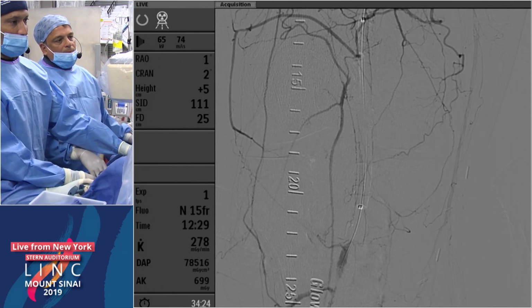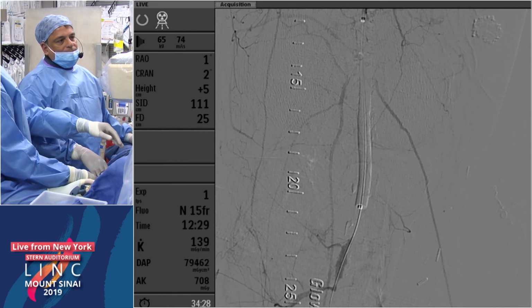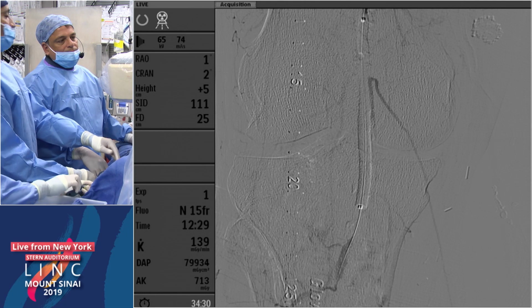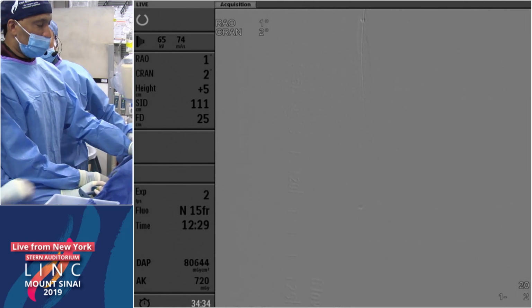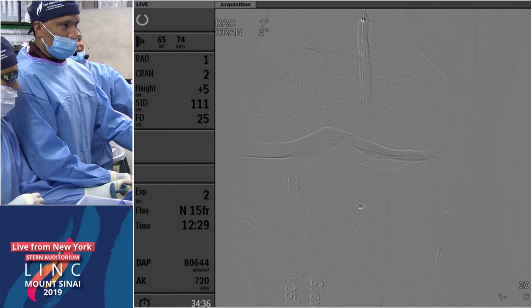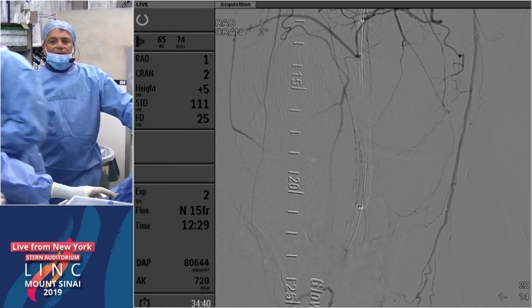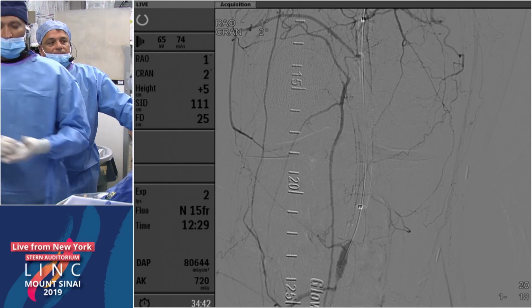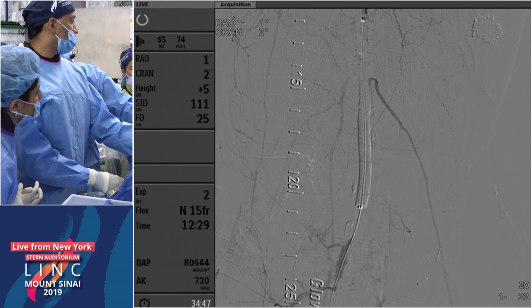I would agree with that. There's good evidence that direct angiosomal revascularization is more advantageous in terms of wound healing times and successful wound healing. But in this case, I think that peroneal is pretty robust, and I'm not sure it's necessary. You can certainly heal without direct revascularization. Yeah, I think some of the recent data that we have, though, with pedal loop reconstruction, to Fadi's point, has consistently shown that there's some better wound healing when you do infrapopliteal work.